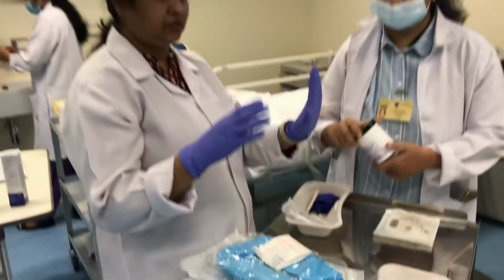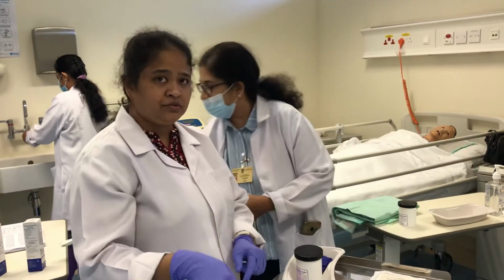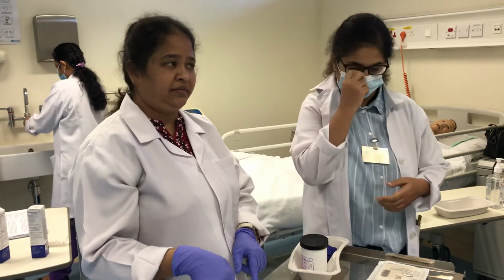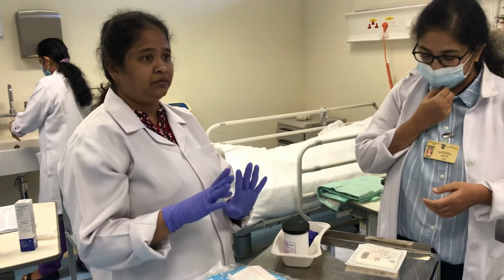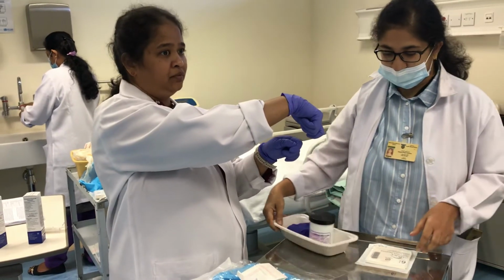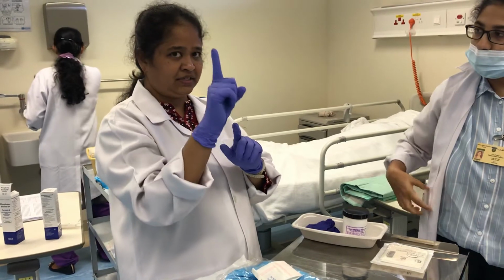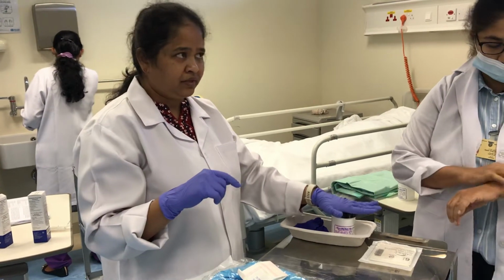Please tell the students also. We used to get that small packet of jelly which used to be here inside. Nowadays they are not bringing it. Sterile jelly only we should use, or at least the tube somebody can give to them when they are doing it. That also today is not there. They always give us that jelly. So we should never use this.